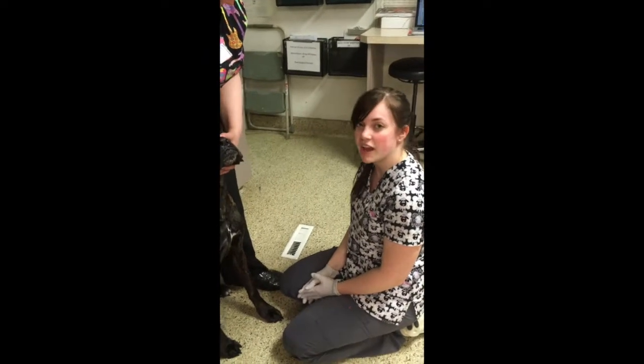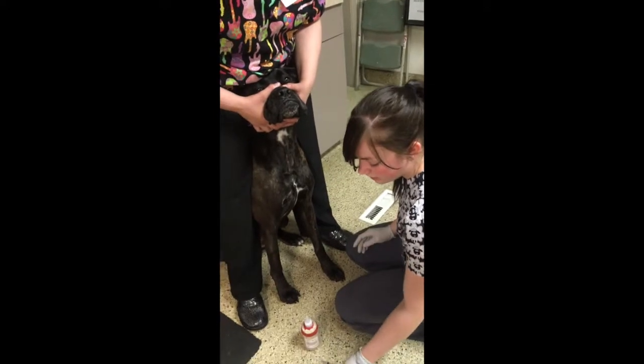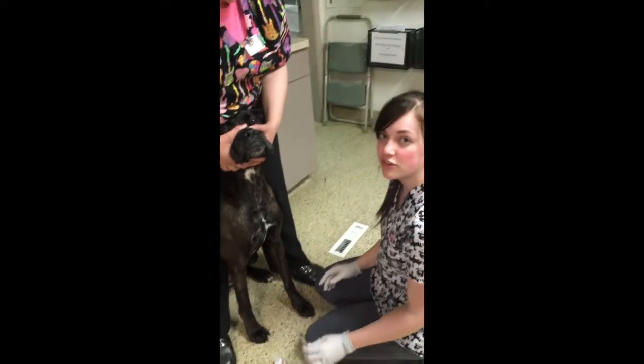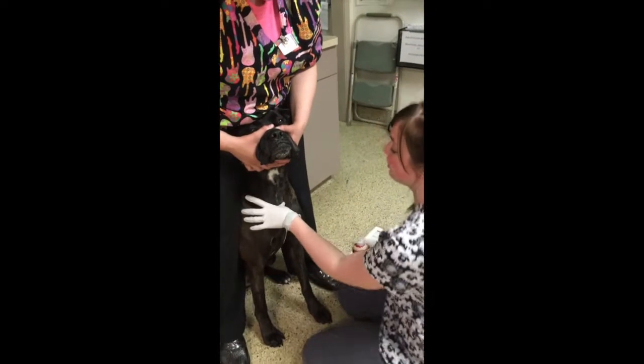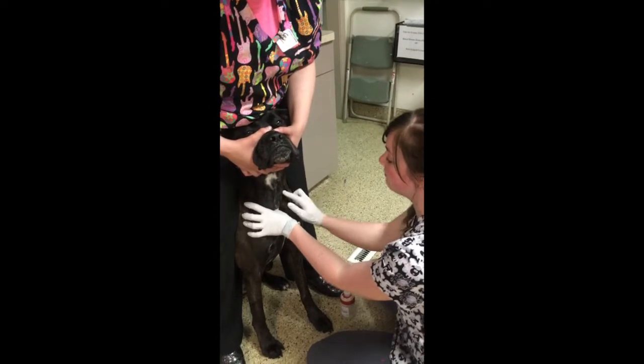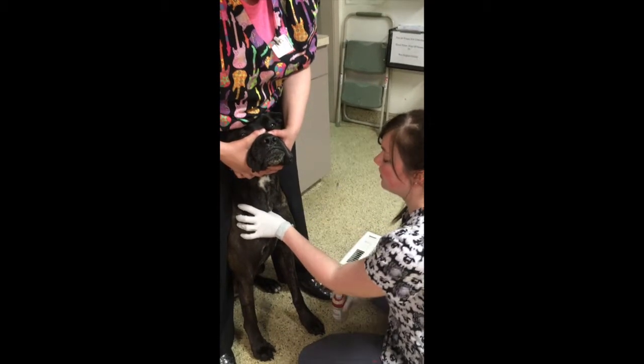This is Ellie. We're going to be drawing blood on Ellie using her jugular vein. I have all the things that I need. I have my alcohol, my 3cc syringes with a 22 gauge needle, and I'm wearing my exam gloves. So what I'm going to go ahead and do is place my finger at her thoracic inlet so pressure builds up in the vein. I'm going to palpate for her vein. I'm going to apply alcohol.